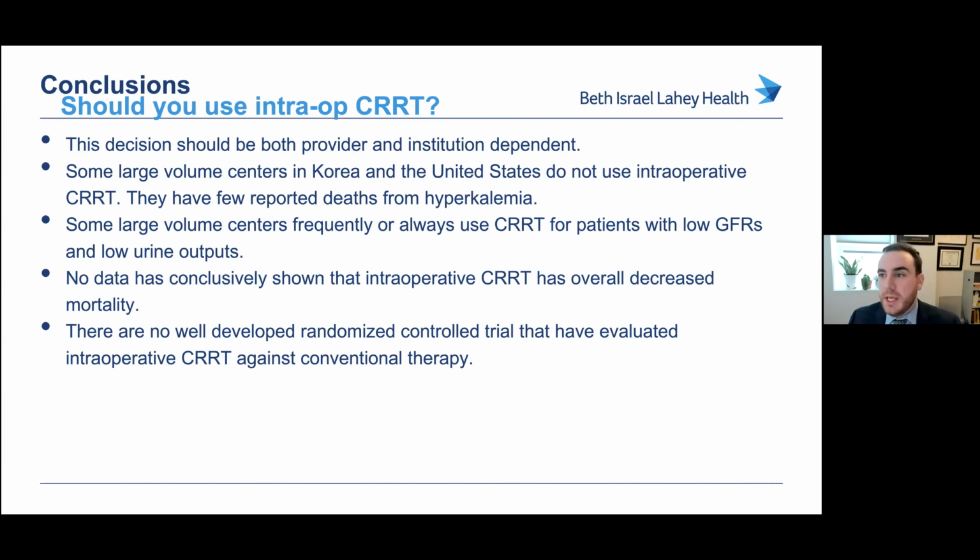Two months ago, he was in the ICU on CVVH, and I'm wondering to myself, if we take 4 or 5 liters of ascites out of him in the OR, and we do need to use renal replacement therapy on him, is he going to have a problem with hypothermia in the OR? And the answer to that question, I think, would be yes.